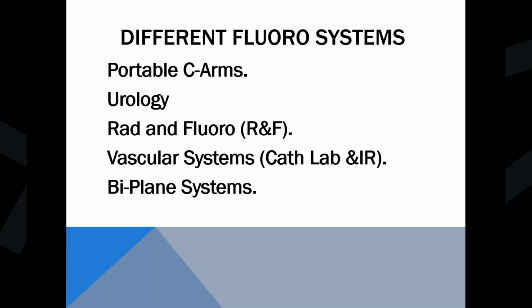Another system that you'll probably see, not in great abundance, is the rad and fluoro rooms, RNF, and these rooms you'll find mostly in radiology. You may occasionally find them in a specials room or even maybe the GI lab.